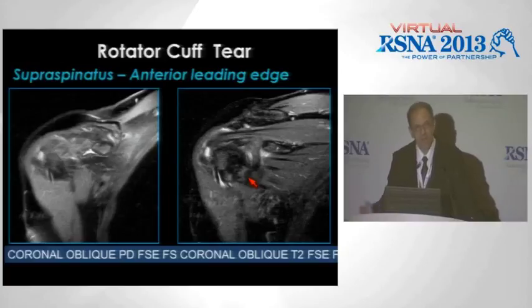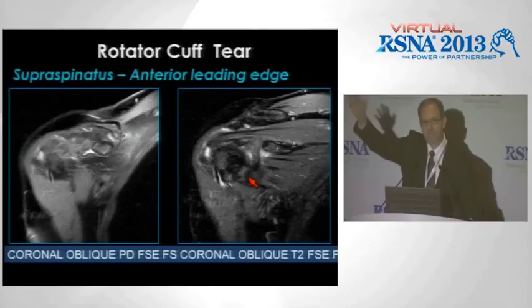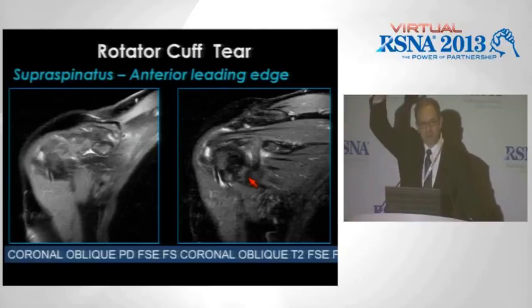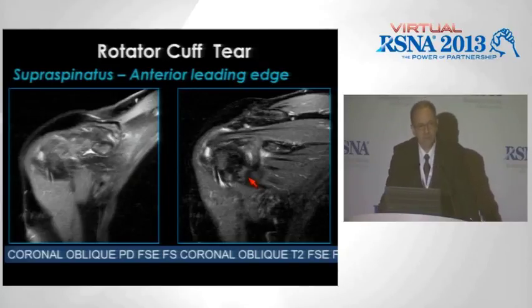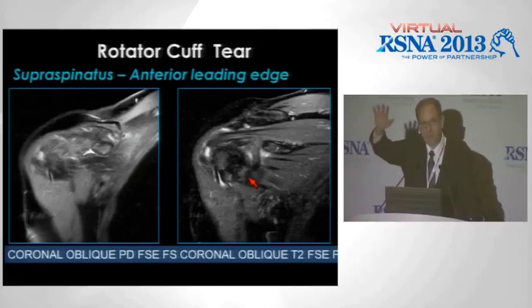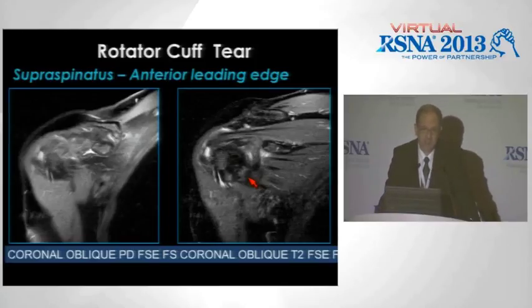And why does that happen there? Because as you go into the hailing a cab position, you internally rotate and elevate the arm. And that brings your supraspinatus and greater tuberosity into contact with a subacromial spur or the anterior undersurface of the acromion. So that is the position you don't want to get into if you have impingement. Now, why do older people get so much rotator cuff pathology?